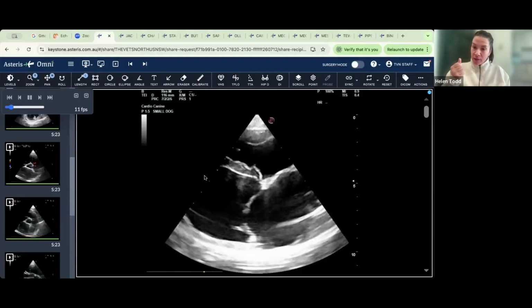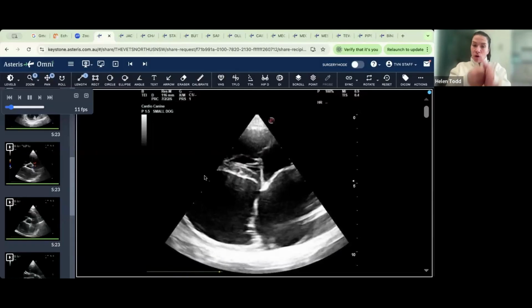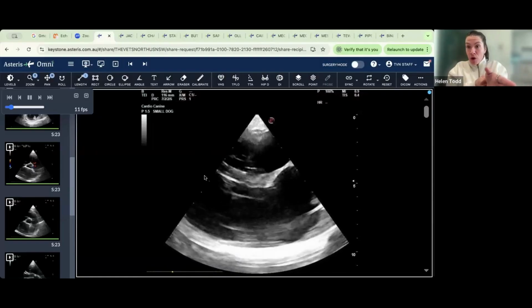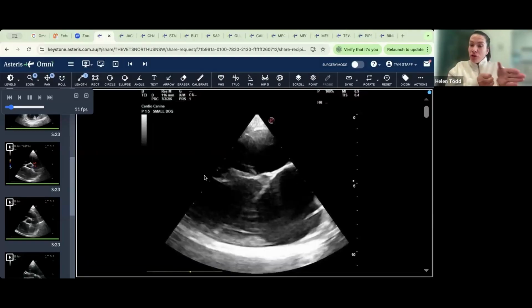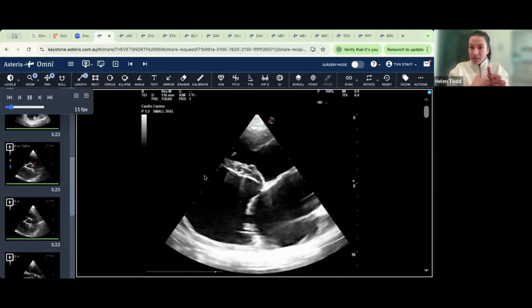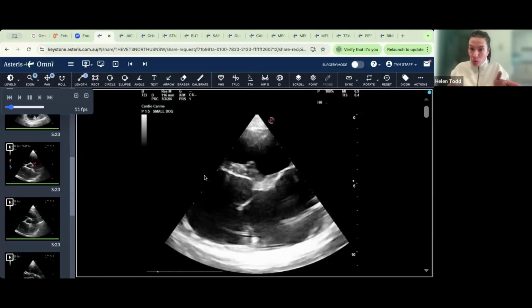So if you have a cardiac probe set up, your notch or your light in this view, in long axis alongside the heart on the right side of the chest, the light of the probe will be facing towards the patient's head. But if you're using an abdominal probe to practice these views in practice, just rotate your probe 180 degrees, the opposite way to what you're used to using it, with the light now facing caudally.